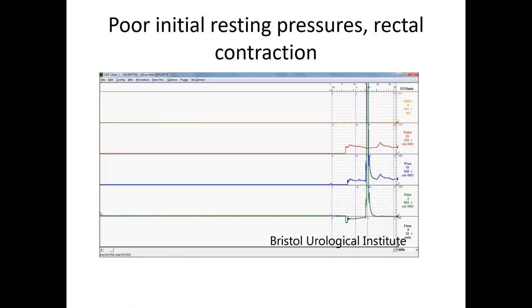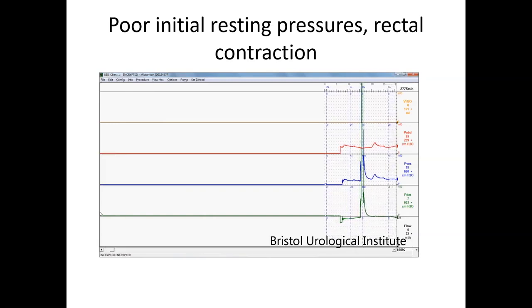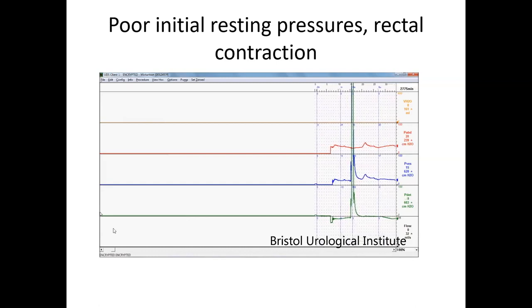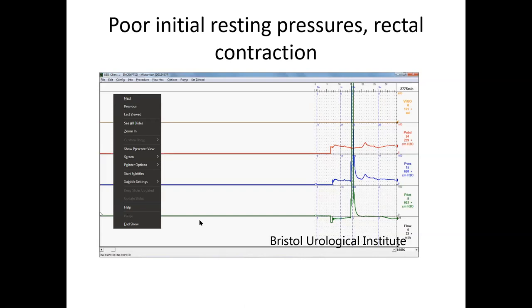Okay, so you're happy now that it's recording nicely. The last thing that is evident on this is what? So what's starting to happen now on the detrusor line, for those of you who can see that? Can everyone see that there's a decrease on the detrusor line? Yes, perfect, Nick. So your PVES, your detrusor is becoming negative, fab.